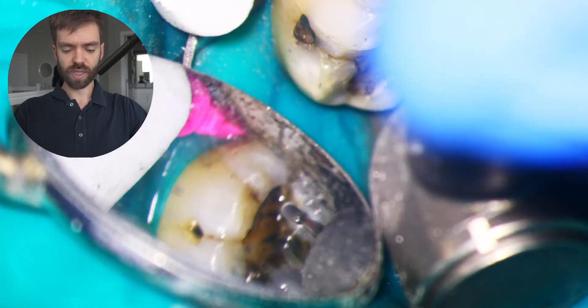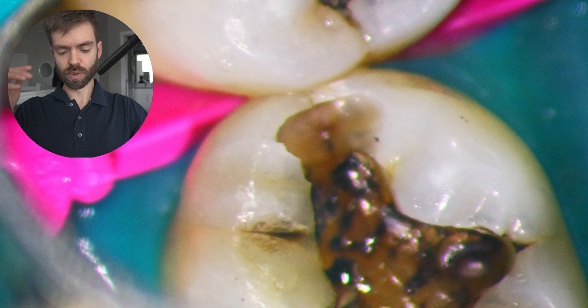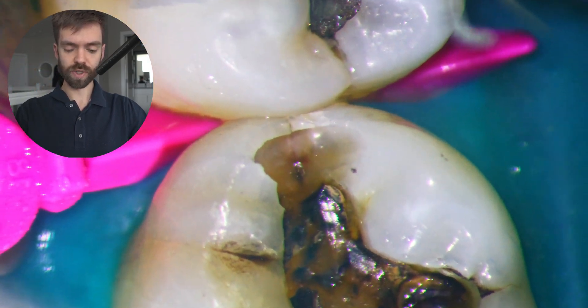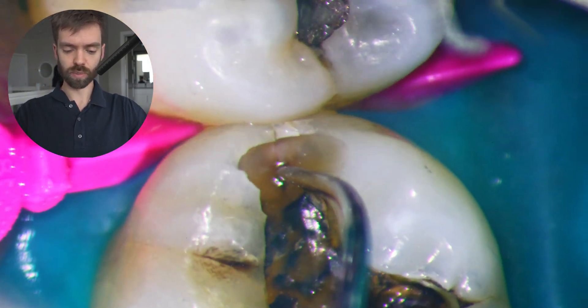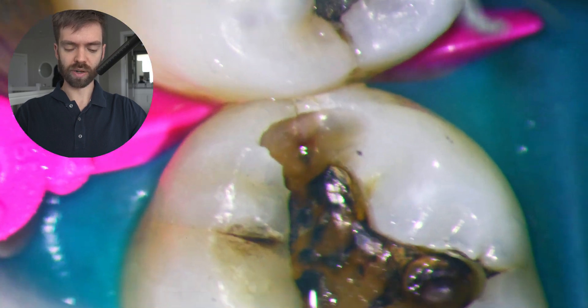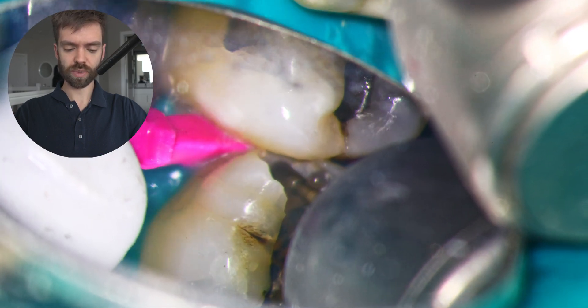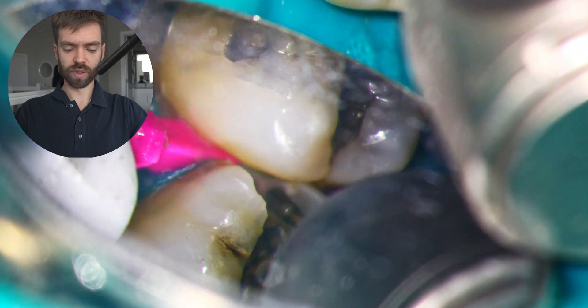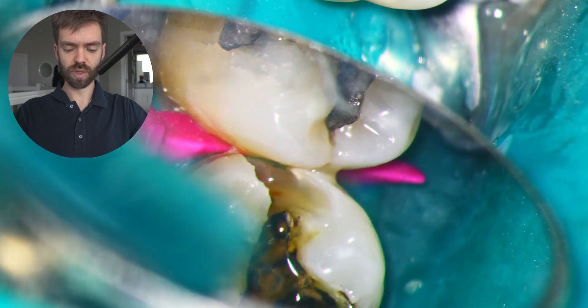Now you'll see a little crack on the backside of the tooth that we're eliminating right now. That's where the cavity was. You can see that little dark spot—I'm going to point to it there. That's soft and we want to get rid of that. So we've got to open that up, clean it all out, make sure that there's no decay associated with this tooth anymore.